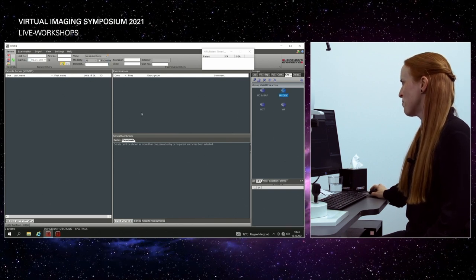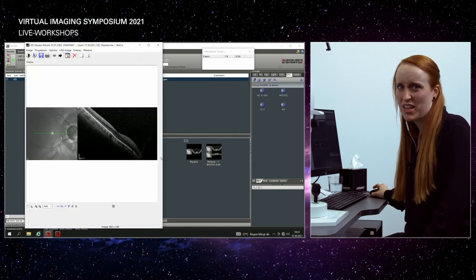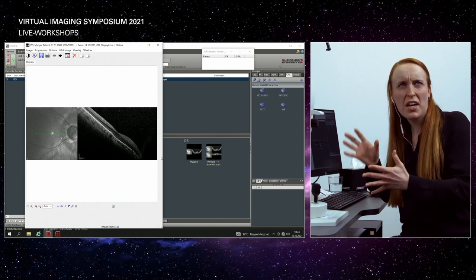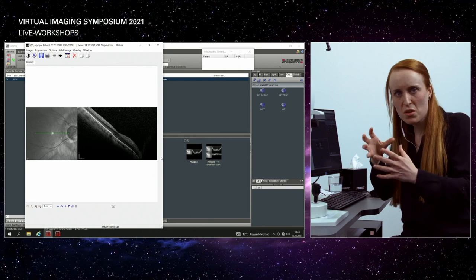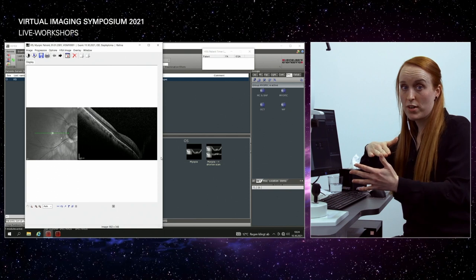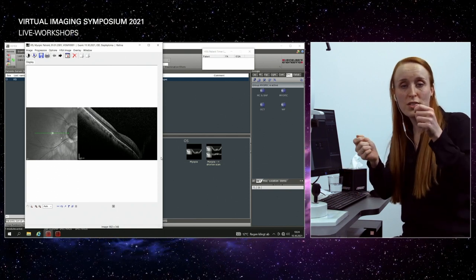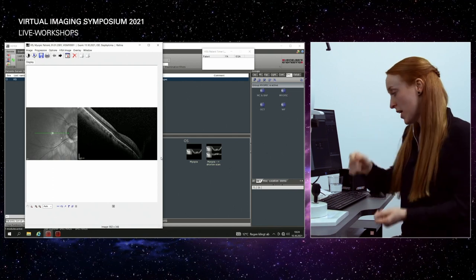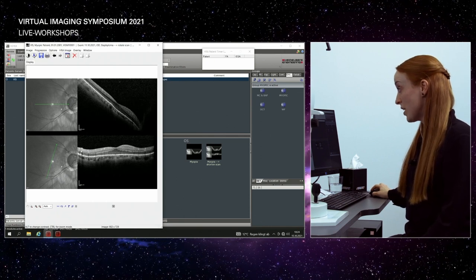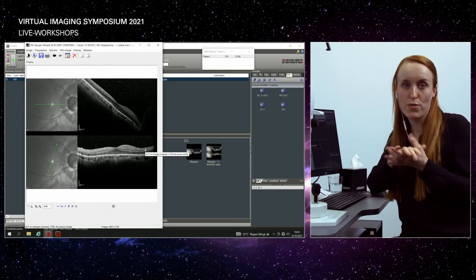All of you probably know them, we might have staphyloma, okay? And usually you will take your camera, you see, on the right corner this image is not that good. I'll just take my camera to the right side and everything will be fine again, but it's not in staphyloma, okay? So what you can do here is just change the direction of your scan like this, and then you will be able to see everything in one line again and have no blurry side of the OCT scan, okay?